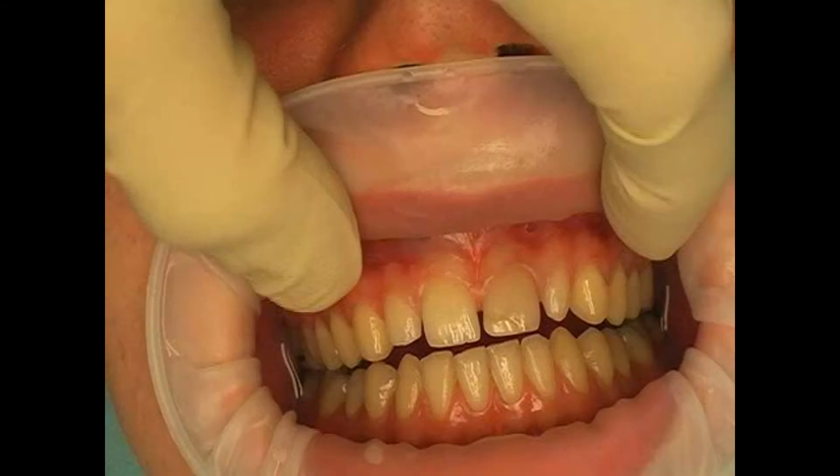Gingival margin cut is the term used for a special incision used in oral surgery. If the mucosa must be folded to the side during surgery in order to get to the underlying bone, for example, then different types of incisions can be used. One of these is the gingival margin cut.